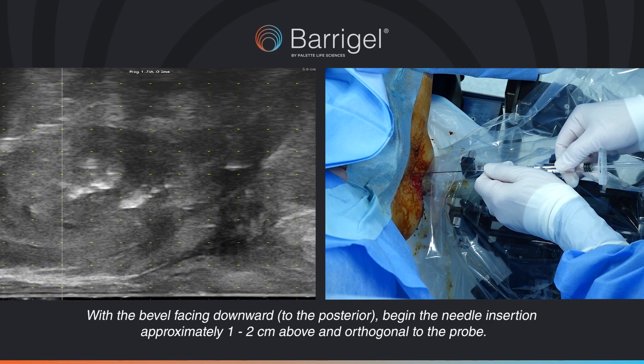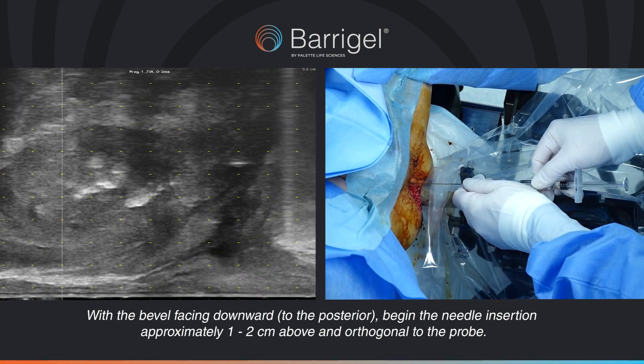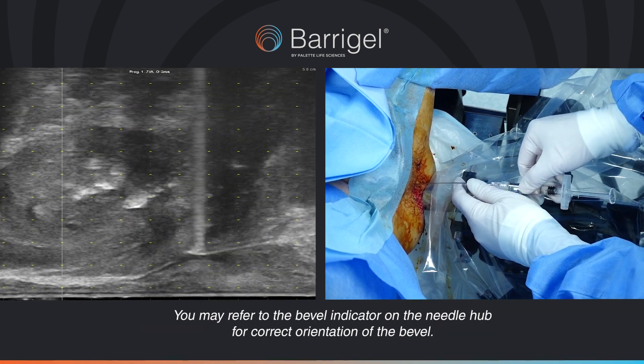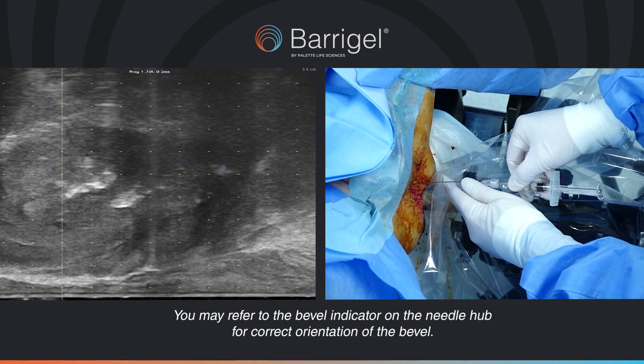With the bevel facing downward to the posterior, begin the needle insertion approximately 1-2 cm above and orthogonal to the probe. You may refer to the bevel indicator on the needle hub for correct orientation of the bevel.